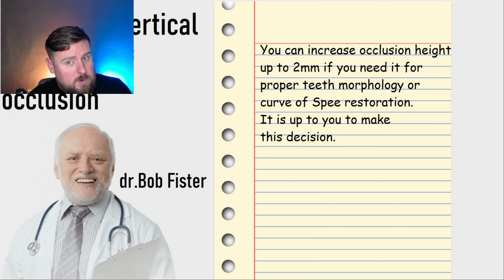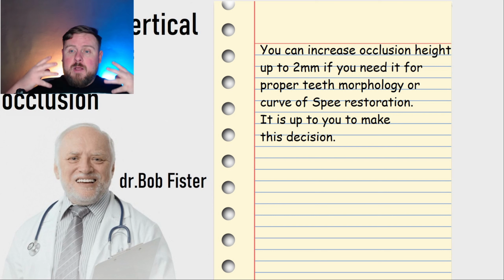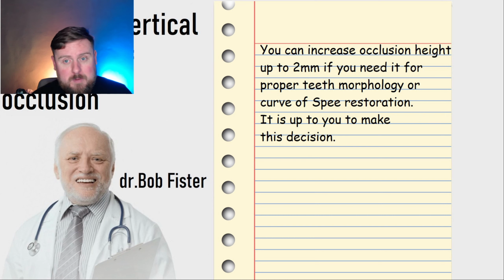If you think so, and if you see that you need to form occlusal planes and the curve of Spee, and you need more space, you can open the bite maximum at the most 2 millimeters. If you need only 0.5 millimeter, please open 0.5 millimeter, but please do not open more than 2 millimeters.